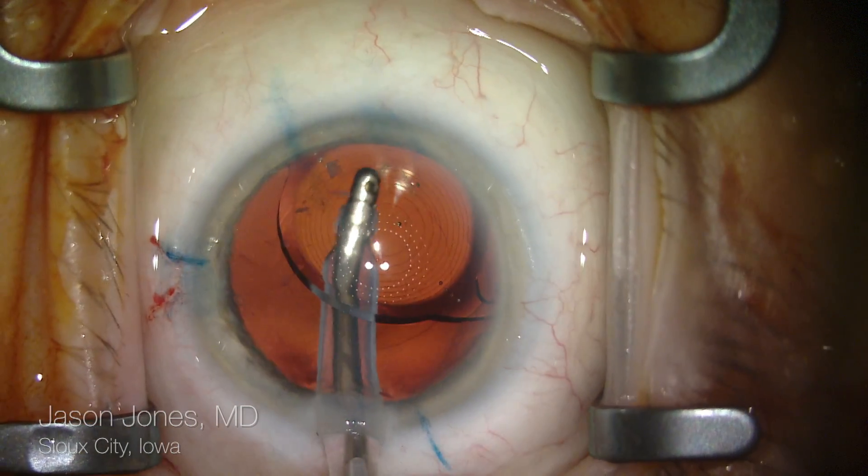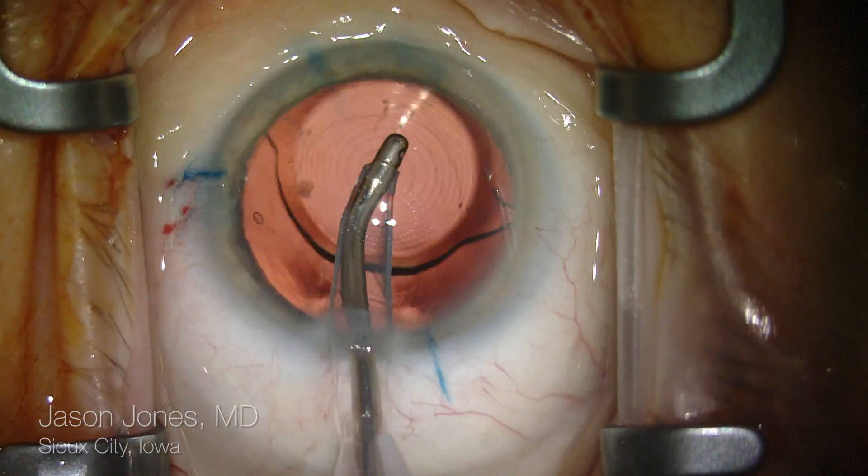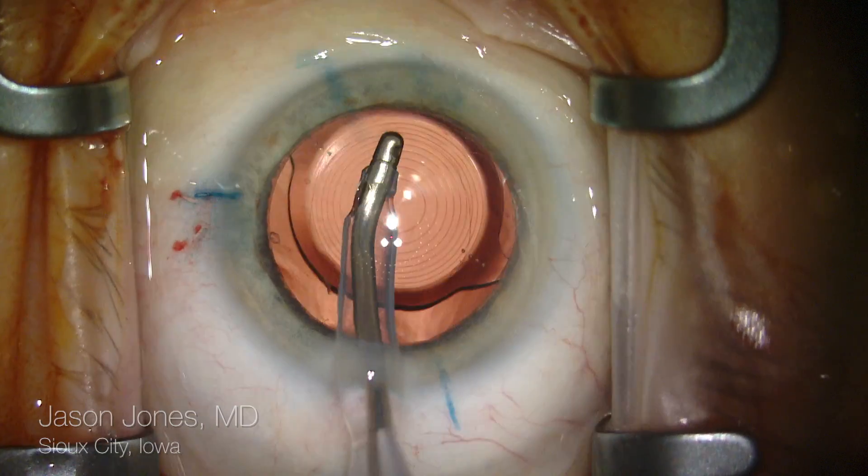I'll place the lens into the capsular bag and I'll bring up my ring light array for orienting the centration of this lens.